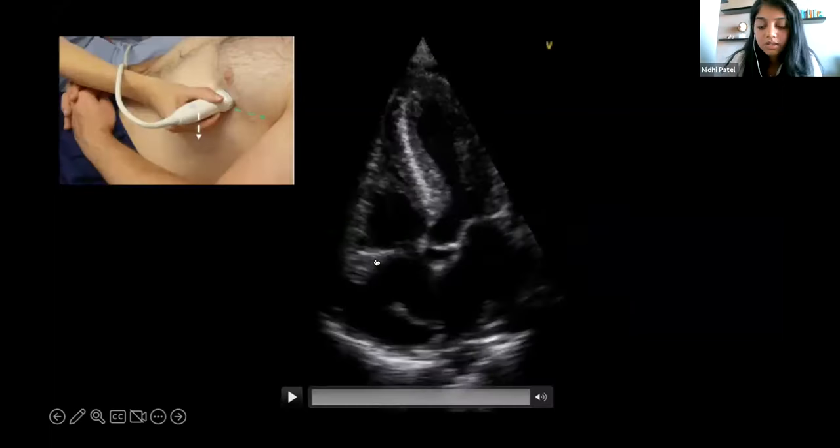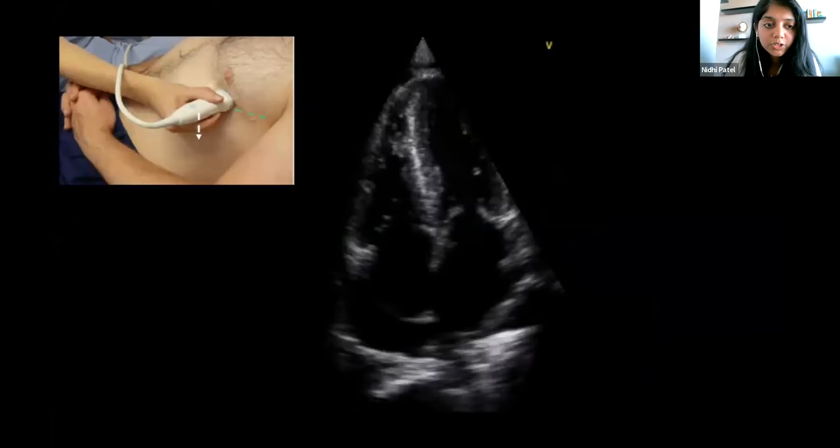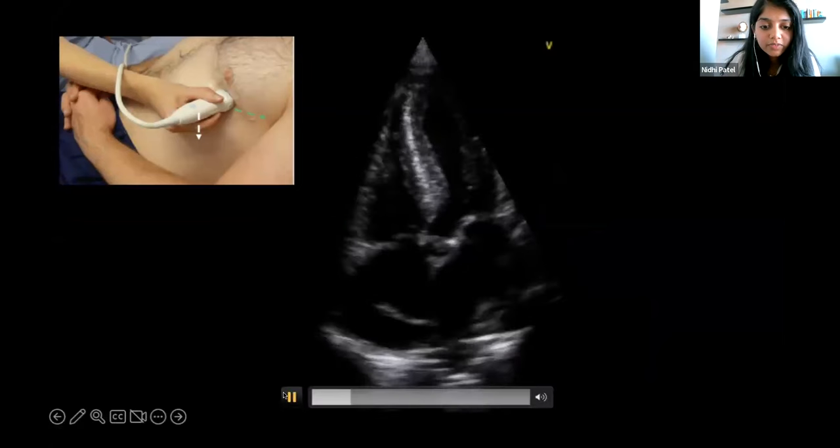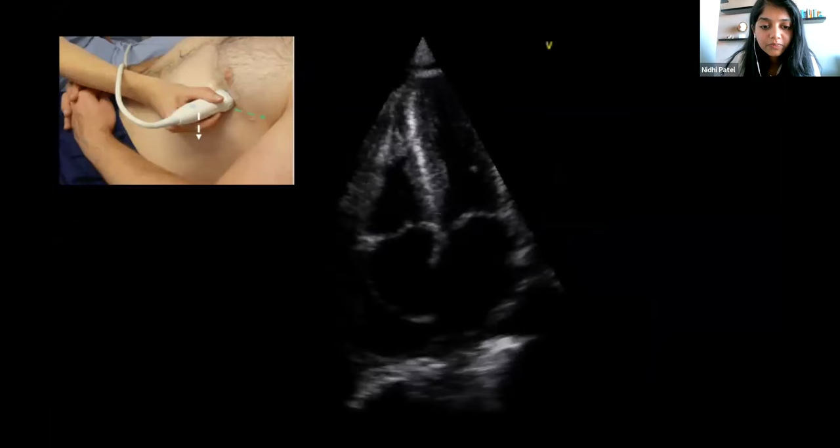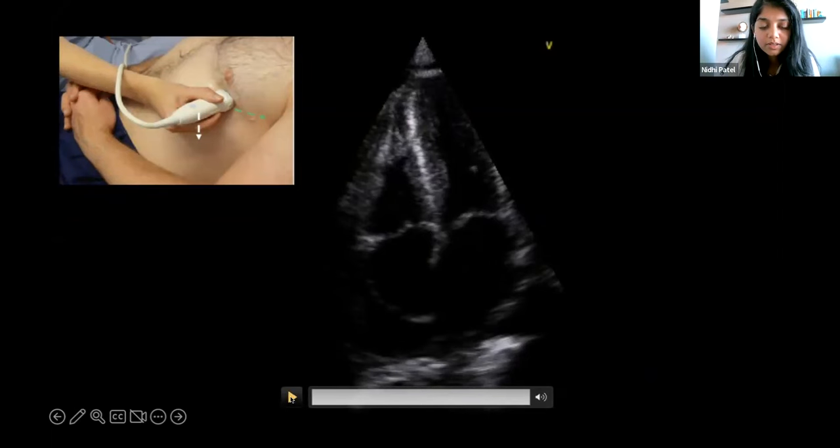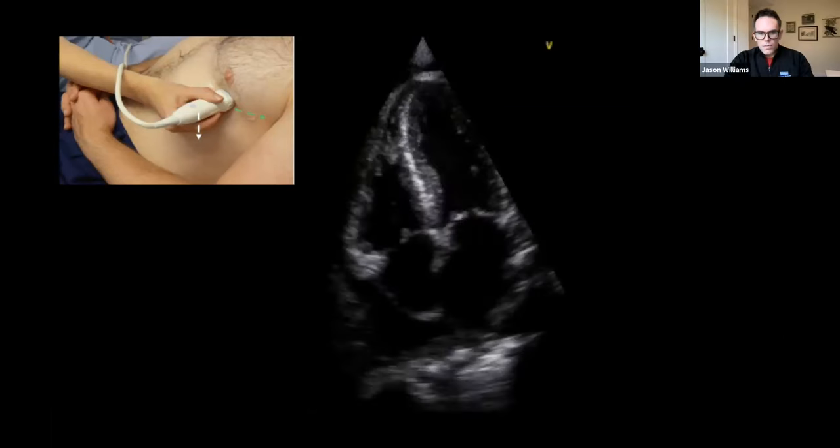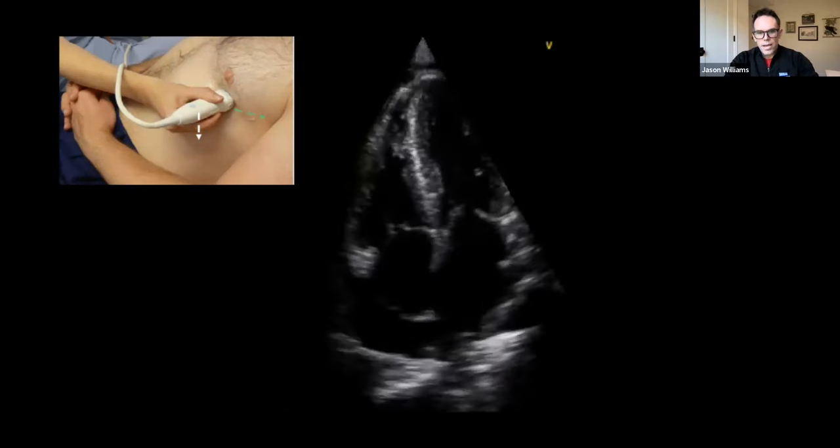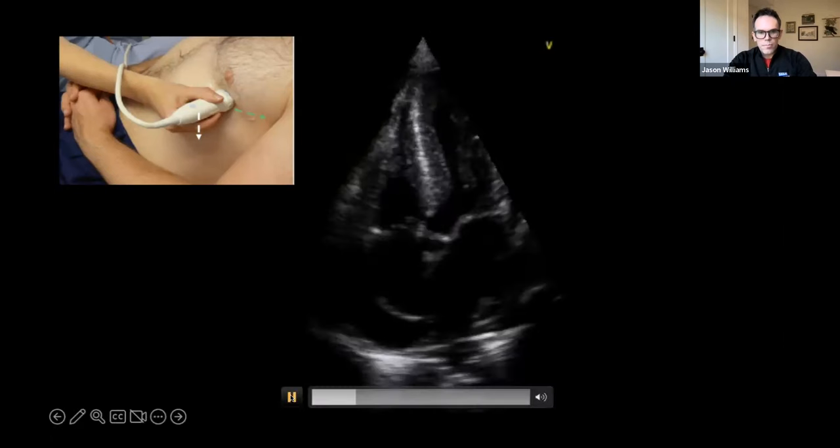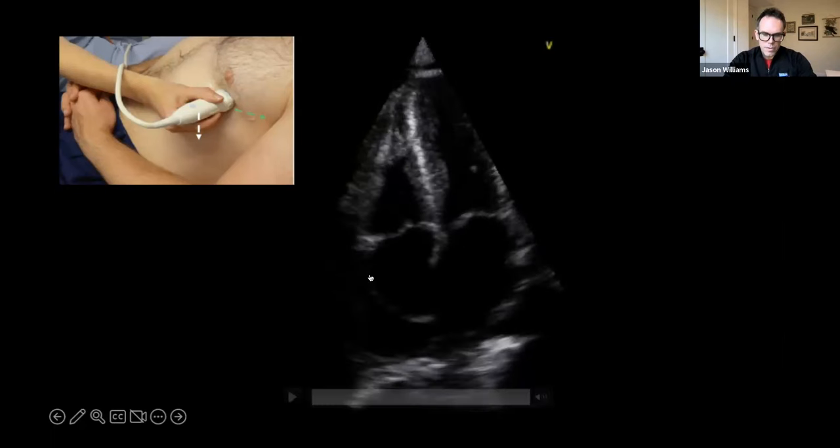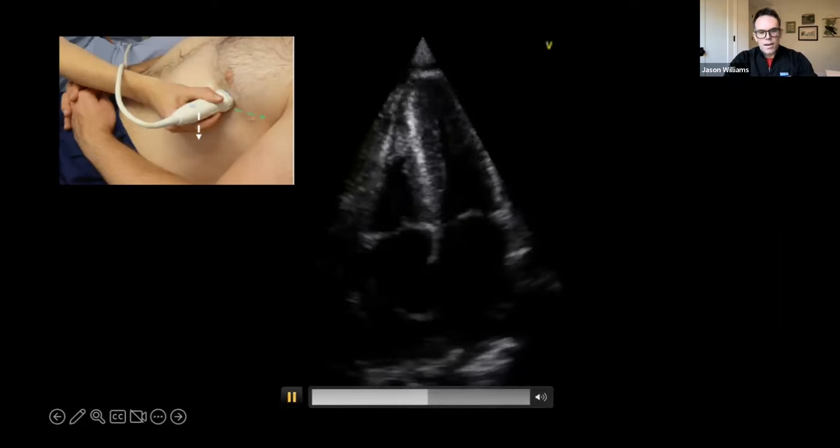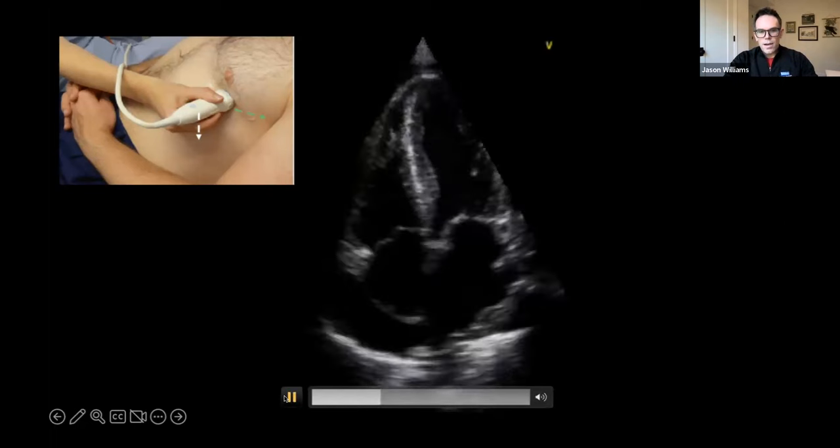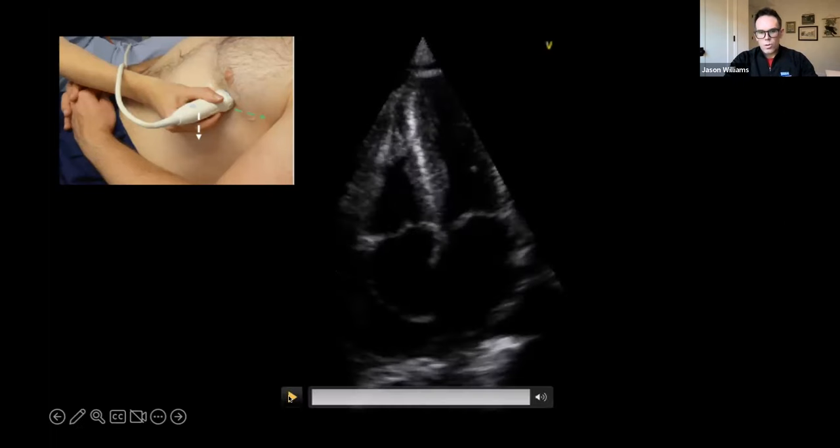Awesome. Thanks Dr. Williams. And then this is the four chamber view of the heart, kind of looking up at the heart, like your probe is a flashlight. And so I can orient you guys. So this is the left atrium. This is your left ventricle, your right atrium and your right ventricle over here and then the septum. Yeah. So when I'm in this view, if I'm thinking about tamponade, I'm kind of training my eye on the right side of the heart. The right atrium is a great place to start. And so I'm looking at that free wall, the right atrium at the bottom, you can see fluid just inferior to that on the image. And it's a little, this is hard to time.